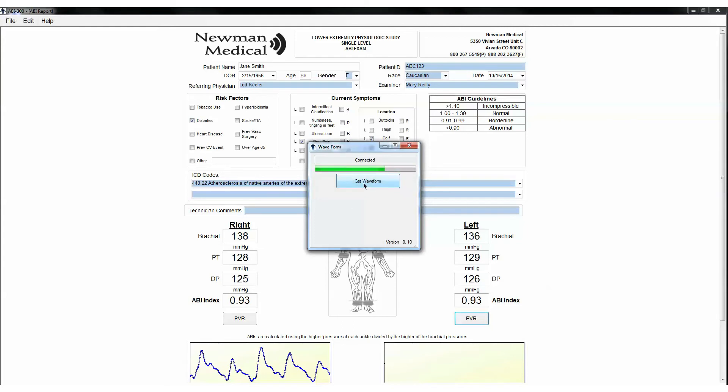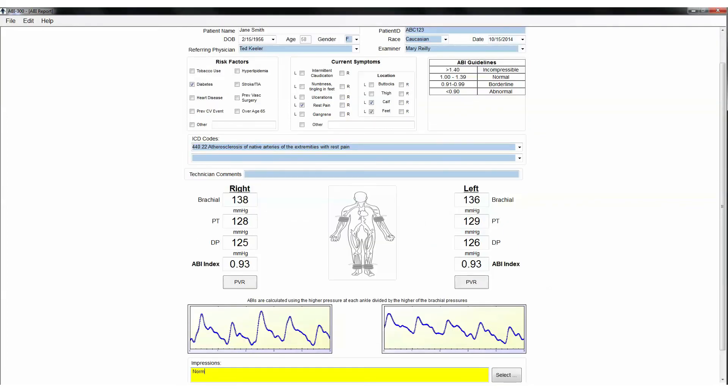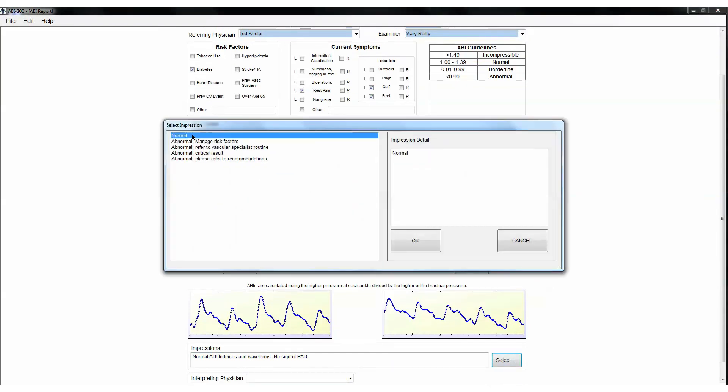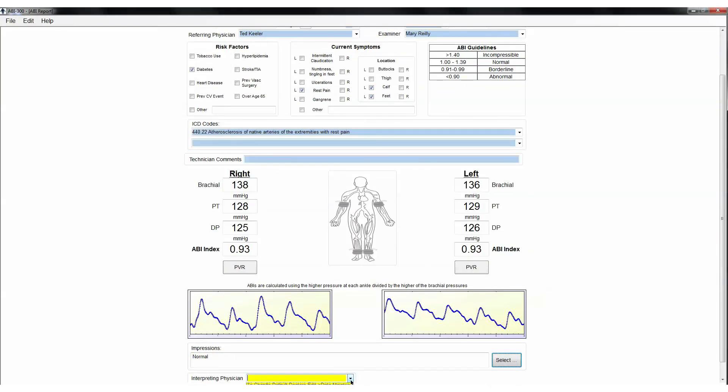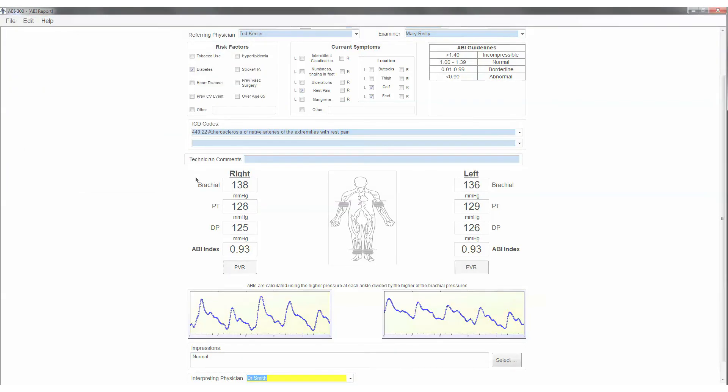If satisfied, deflate the cuff. When finished, you may add or select impressions in the Impression fields. Save or print the report by going back to the File tab. That's all there is to the ABI exam with your simple ABI, ABI 300. Like any procedure, the ABI becomes easier to do with practice.